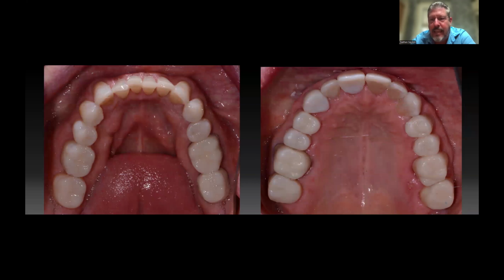And I know you can't see the height differences, but on these lower anterior teeth on the left-hand side here, all of these teeth have a stepped occlusion now because I lengthened these lower teeth back to what they normally should be. Same thing with the upper. These lower teeth strike the upper where he had dug into these, and there's no room. His posterior bite's open after I did this. Completely screwed up his bite. But now I have proper shaped teeth, and the orthodontist knows where to put things. And then at the end of treatment, I just have to turn it into ceramic, right?